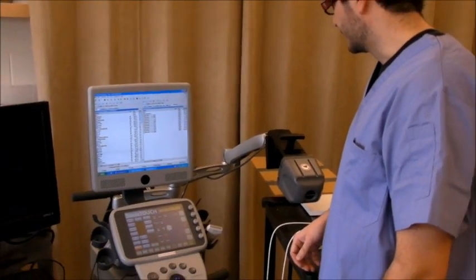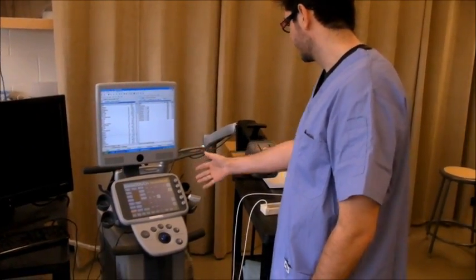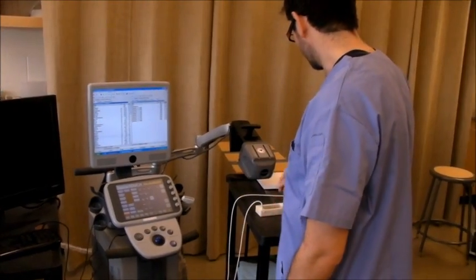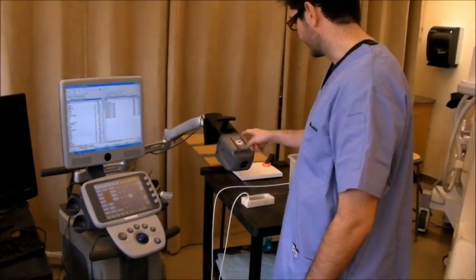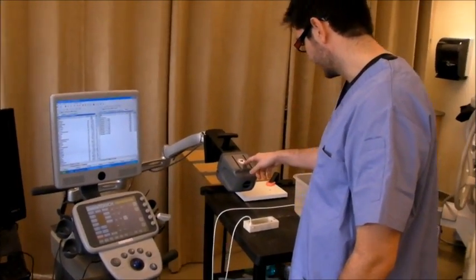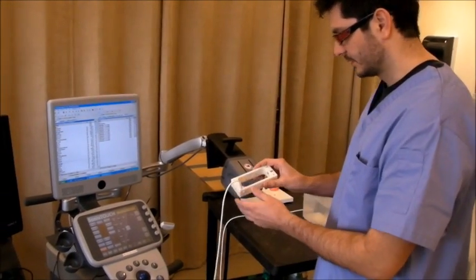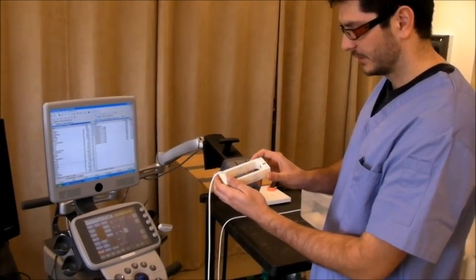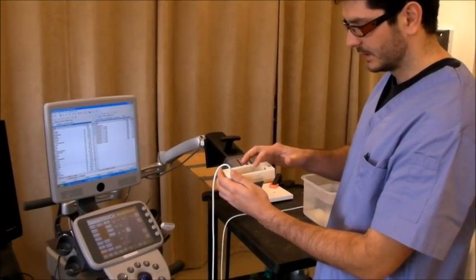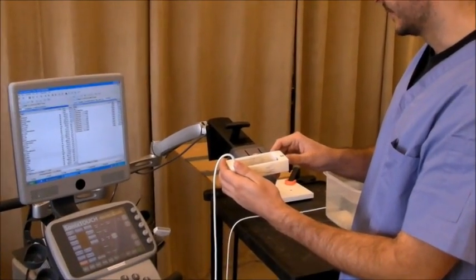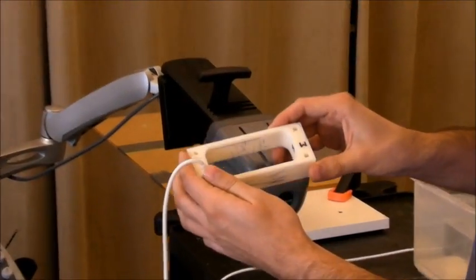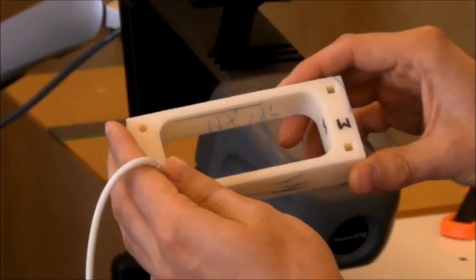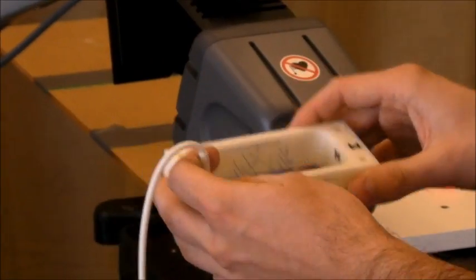For the calibration we use a Sonix Touch ultrasound machine with attached NDI tracking system. We use an fCal Phantom with three N-wires. You can find a tutorial about how to build it on our wiki pages.